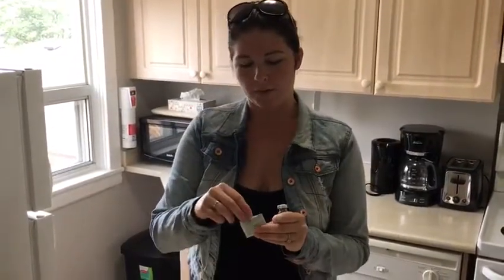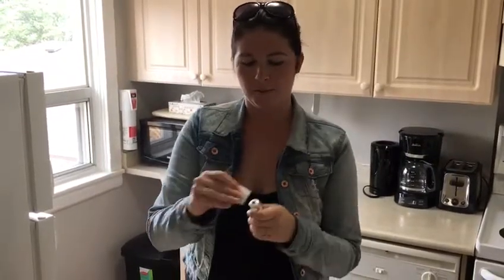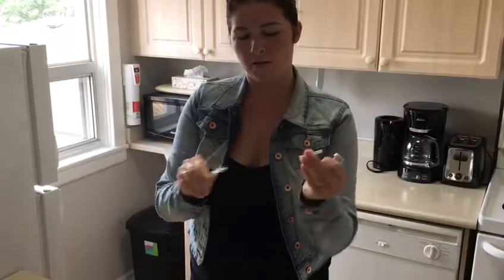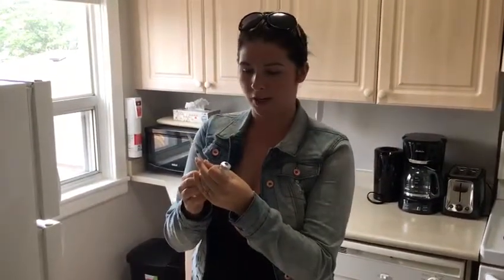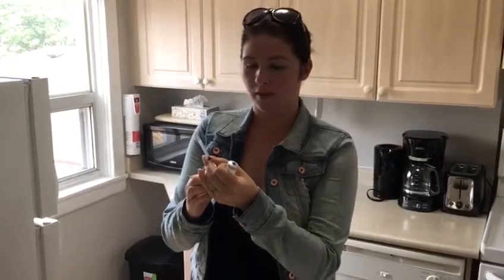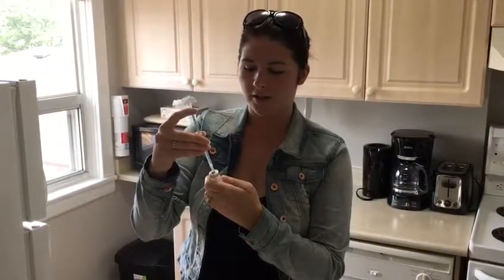To start off, I want to open up my alcohol swab and I'm going to wipe off the top of the container. Then I'll get my needle. I want to put air into the syringe first and inject it into the vial — if not, it'll be really hard to get the medication out. So I'm on a dose of 0.8 milliliters, so I'll pull it back to 0.8 and inject into the vial.